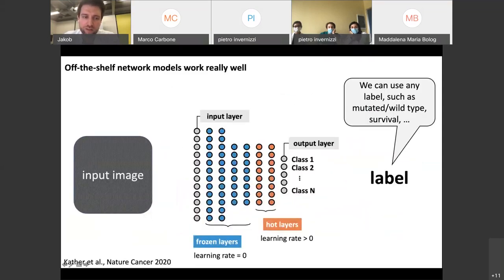And when I talk about networks, what do I mean? Well, what we are working with is artificial neural networks. This is the technology behind deep learning, and that's a very simple model that we can simulate in a normal computer that you may have at home. For some tasks you can even use your laptop. What this is doing is that it simulates the neural network that we also have in our visual system. Our visual system, starting with the retina up until our visual cortex, is composed of many millions of neurons, which are interconnected and which can transform light into something abstract and enable us to, for example, recognize objects and navigate the physical world.